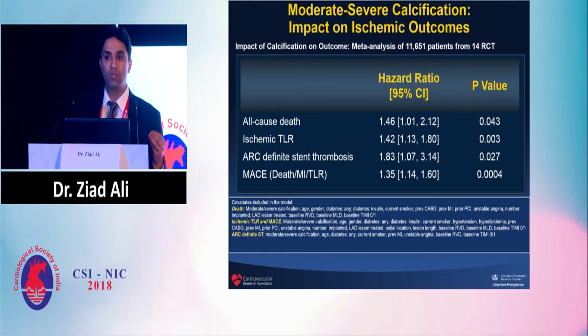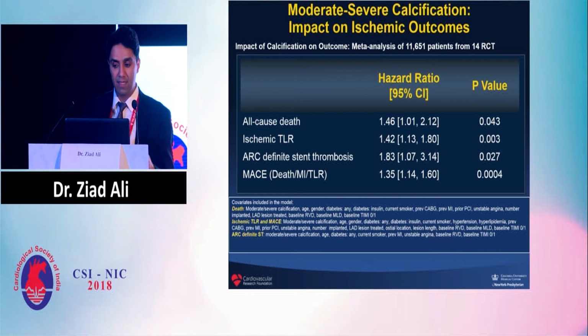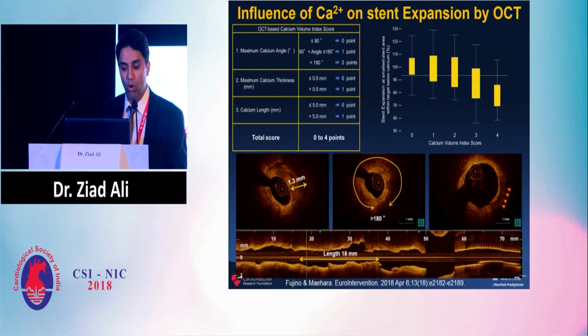And put simply, there's only one explanation for why this is. And the explanation is that we are implanting the stents into severe calcification without appropriate vessel preparation, leading to stent underexpansion. How can OCT help?